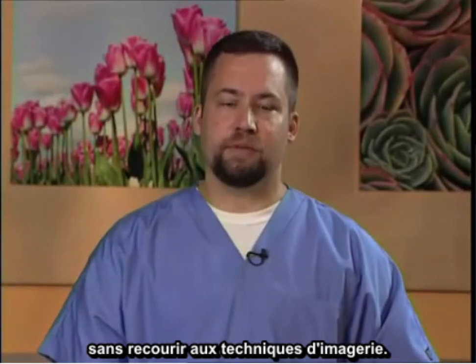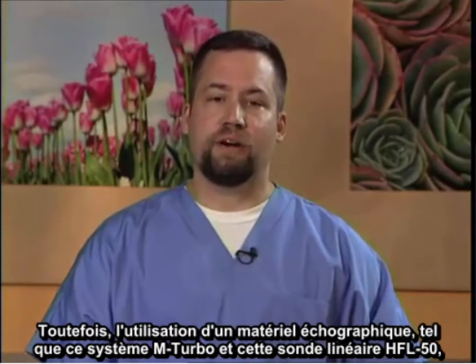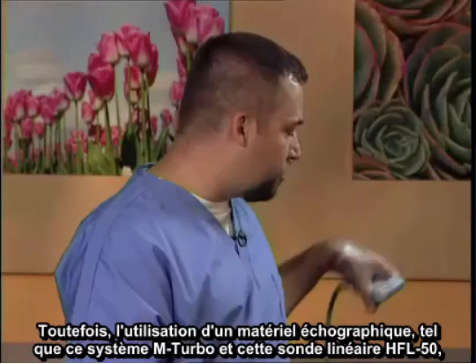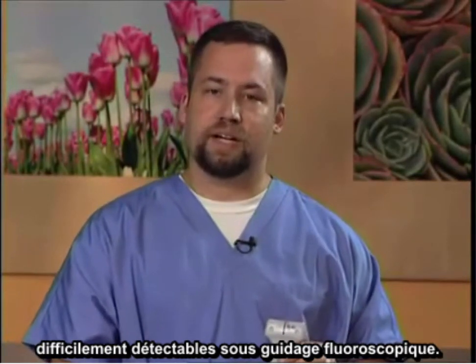Today, I'm going to demonstrate the stellate ganglion block performed under ultrasound guidance. Traditionally, this block was performed blindly without the use of any imaging modality. Currently, fluoroscopy is a preferred method; however, utilizing ultrasound such as this M-turbo system with the HFL-50 linear probe, this can be done with less radiation and avoidance of vascular structures that might not otherwise be seen under fluoroscopic guidance.